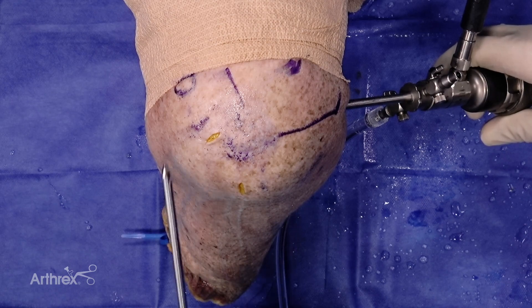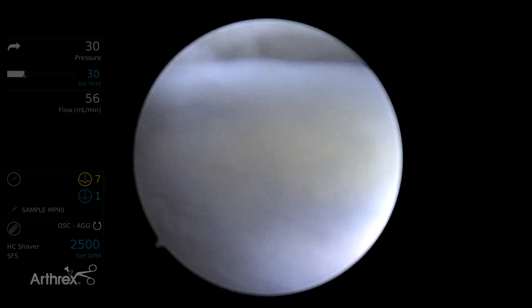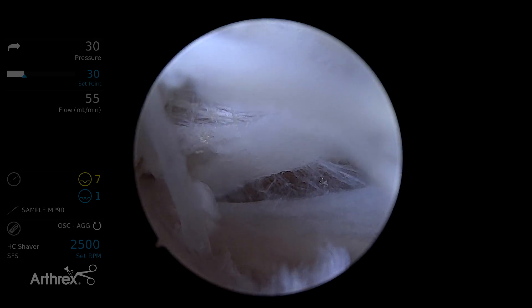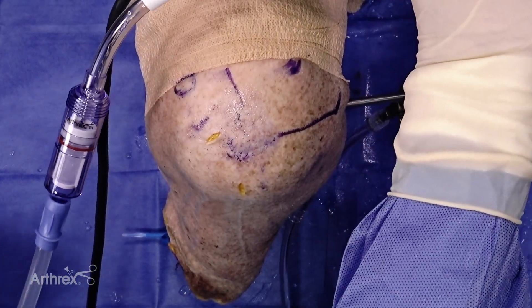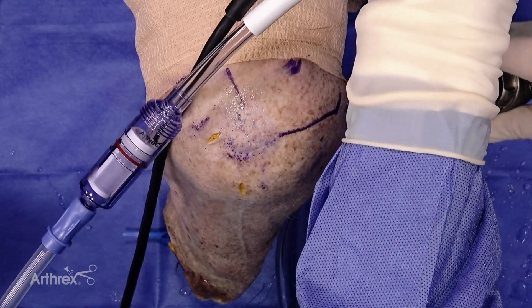I'm looking through a posterior portal right now, working through a lateral portal. I've got my bursa here. This is cadaver tissue, so I haven't really exposed my rotator cuff yet. I'm going to go ahead and show you this GraphNet — I have it hooked to the back of my suction right here. Here's my shaver; I have it hooked to the suction, something that's very easily done on the back table by your assistant prior to the bursectomy.